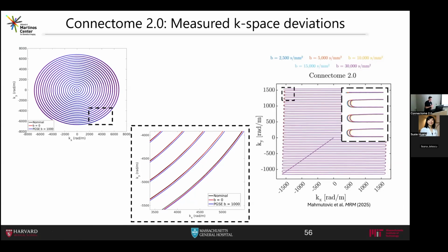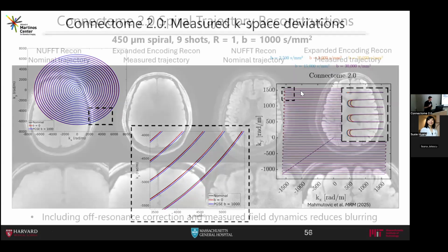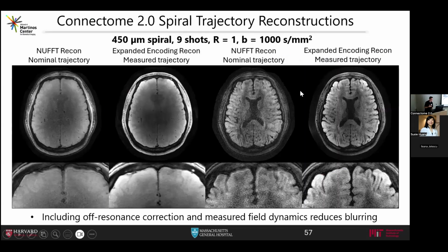And then extending this with higher and higher b-values, you can see for this EPI the trajectory is shifting from left to right with b-values upwards of 10,000. We also want to extend our applications to non-Cartesian trajectories. What field monitoring can do for us is for something like spiral, since spirals are very sensitive to these field perturbations, especially if we have the eddy currents from diffusion. So we're trying to target these mesoscopic regimes.